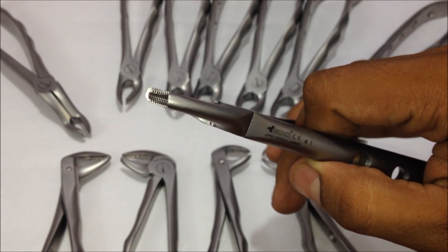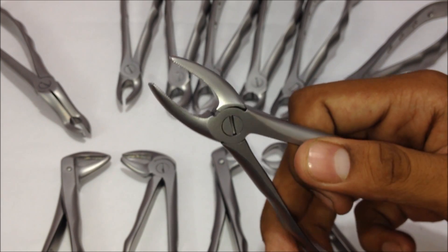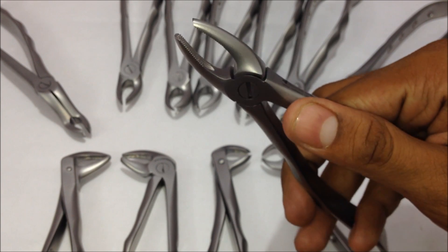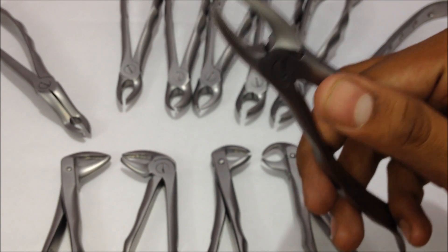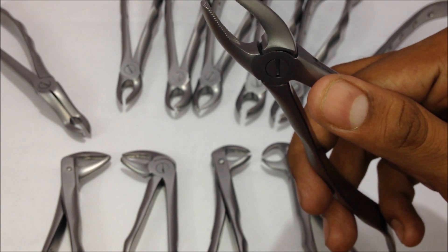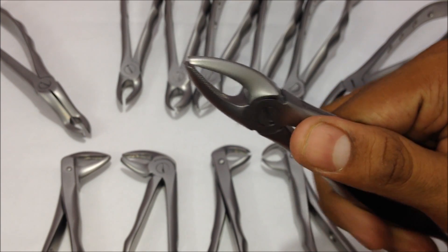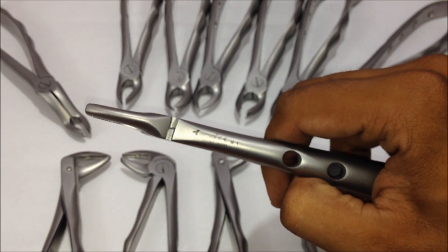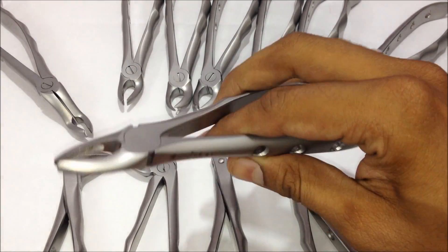These are the various serrations, and there's a grooved area in the beak which helps in the proper holding of the tooth while it's being pulled. Without this, a slip of the tooth can damage the opposite arch tooth structure or fracture the tooth you are trying to extract. This is the number one extraction forceps, used for the upper central incisors.